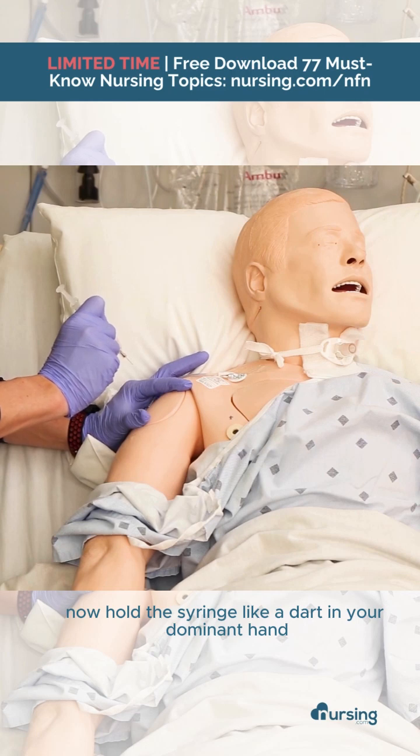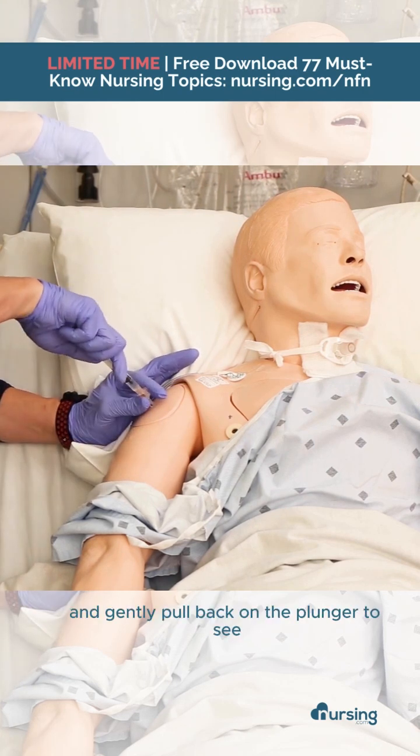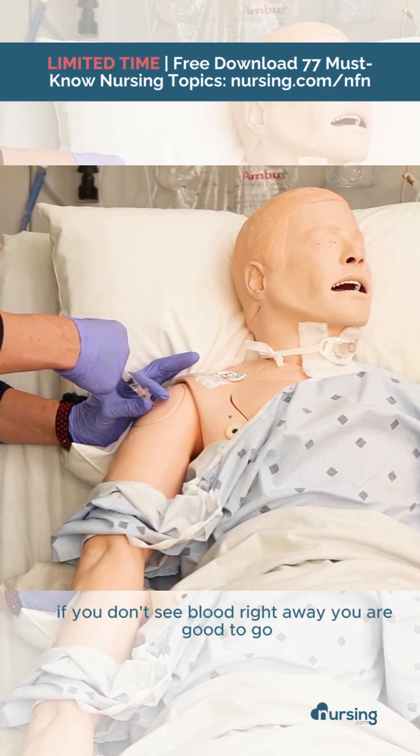Hold the syringe like a dart in your dominant hand and insert the needle at a 90 degree angle. Stabilize the needle and gently pull back on the plunger to see if you have any blood. If you don't see blood right away, you are good to go.